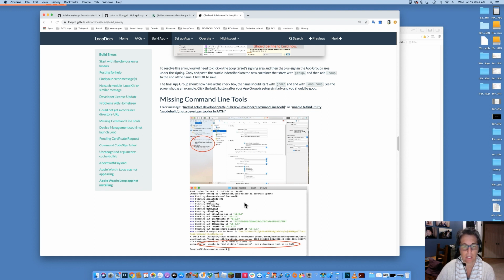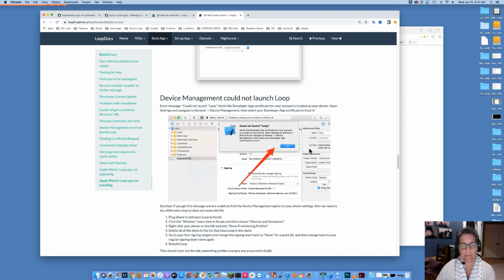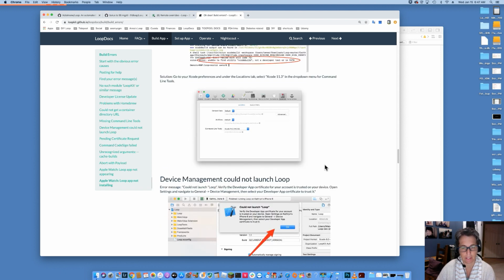That will show up here. That also will show up in the report navigator. I just don't happen to have an active screenshot of that right now. I am looking for one, I just haven't been able to recreate it. However, good topic. If you checked the Xcode preferences, like I showed at the beginning of the video, this won't be the issue because you will have double checked to make sure that it is.